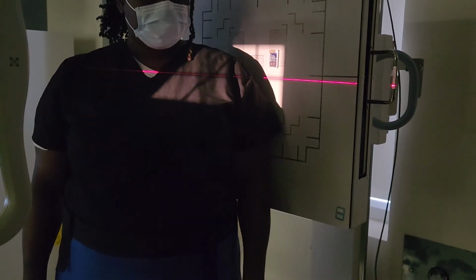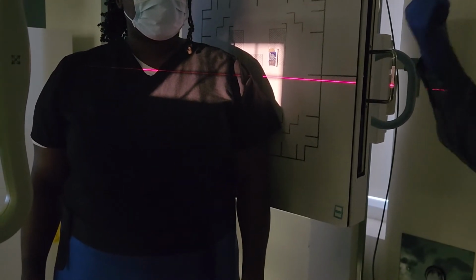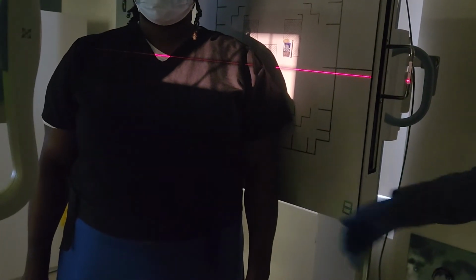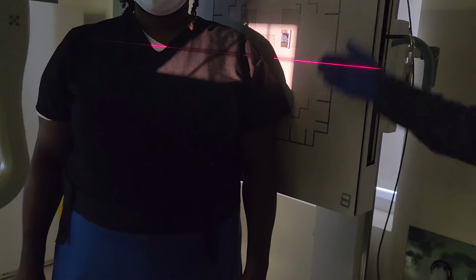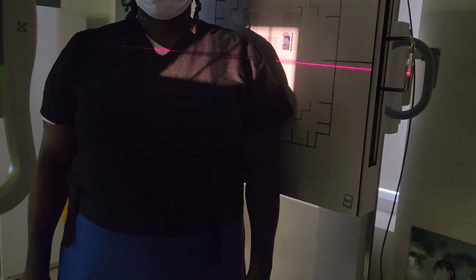Breathing instructions, same as before. Just hold your breath, X-ray, you can breathe. Do we need to do anything fancy with the arm? No, we do not. You can just leave it hanging straight down like this. Okay. So Mr. Donahue says it would be suspended on respiration. For the Grashey?